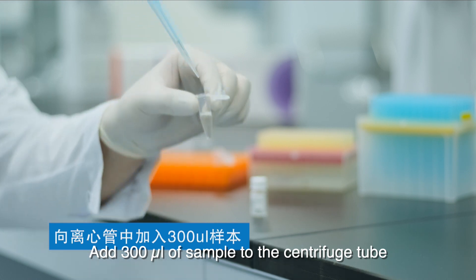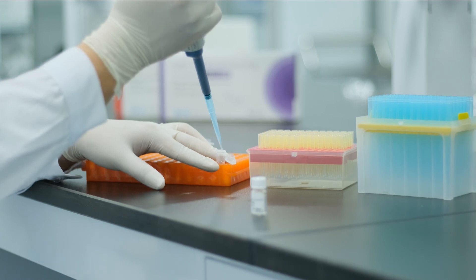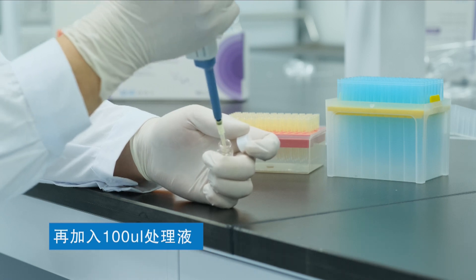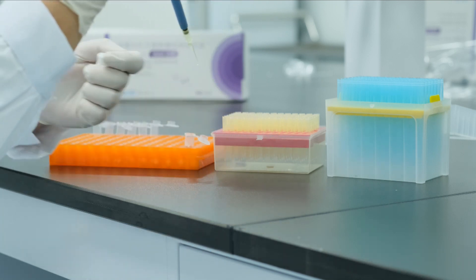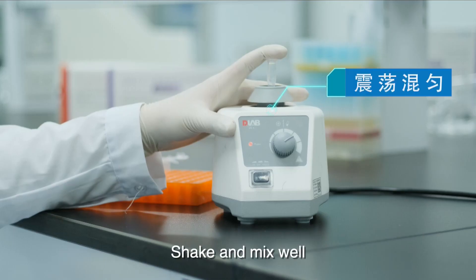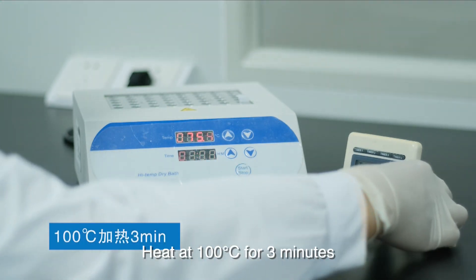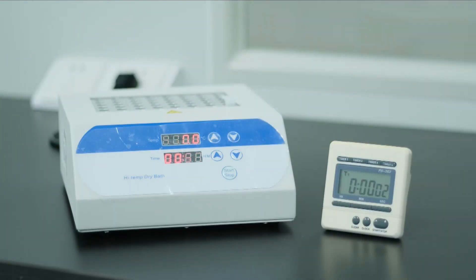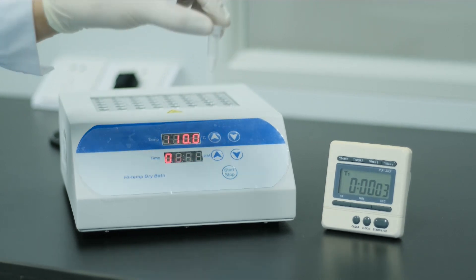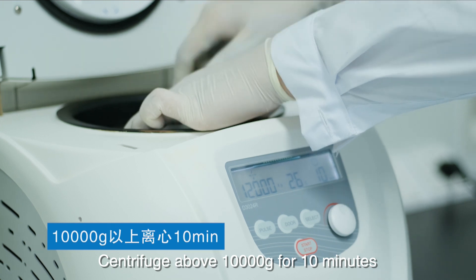For sample preparation, add 3 µL of sample to the centrifuge tube, then add 100 µL of treatment solution. Shake and mix well, then heat at 100 degrees Celsius for 3 minutes. Next, centrifuge above 10,000 G for 10 minutes.